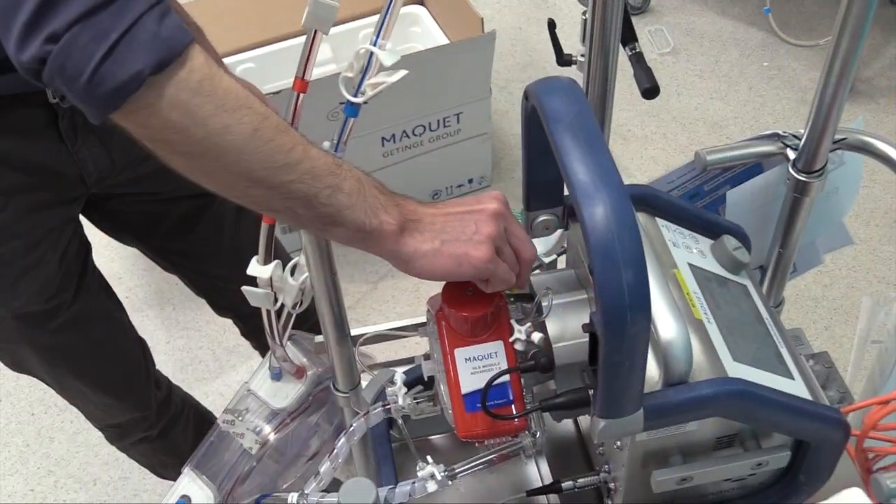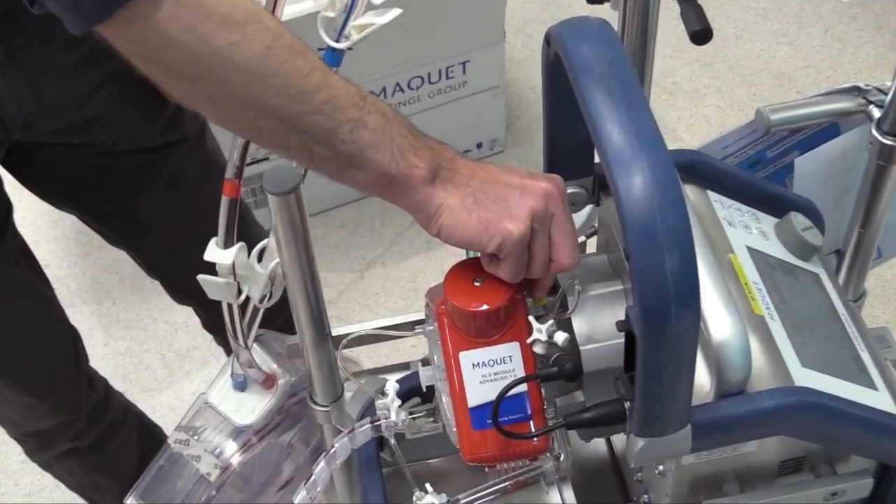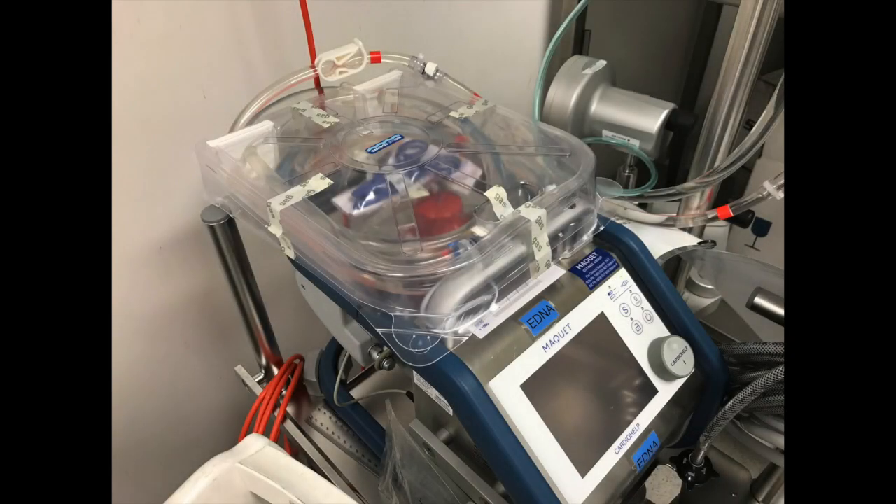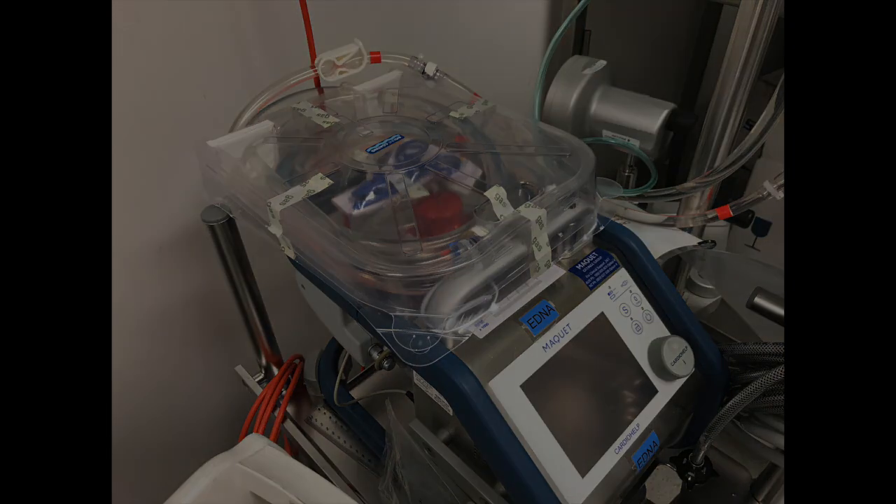Finally, close the de-airing port using the yellow cap. Remove the cap from the oxygen connector and stop the pump. The pump is now ready for connection to the patient by handing the sterile tray to the cannulator.